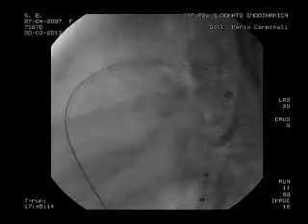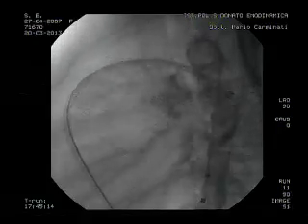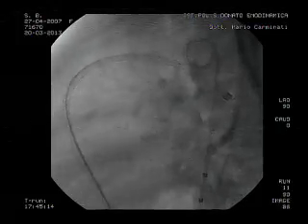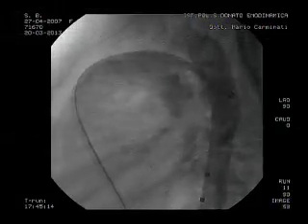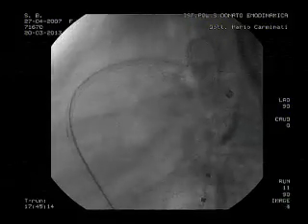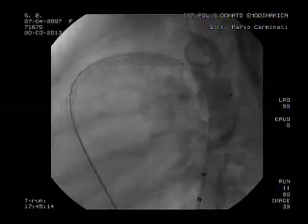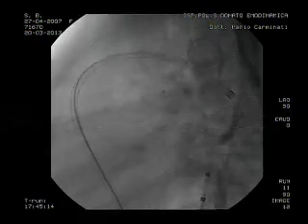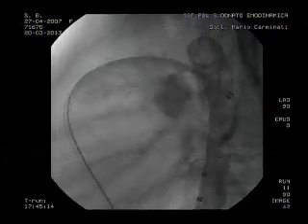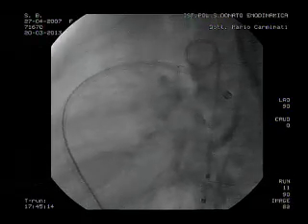You see it's elongated. Well, actually, we measure this length approximately 7-8 millimeters. And I will try to use an ADO2 AS, 6 millimeter long. No, no. Longer than this. You see there are many. I would, well, no. 5, 6.